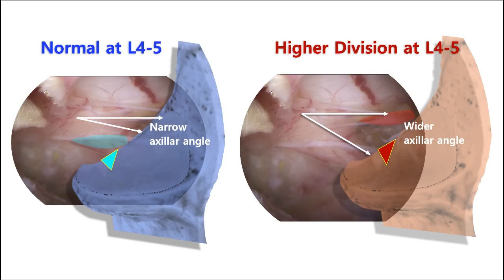When you punch the lamina at the middle of the lower lamina, you could misunderstand the dural lateral side as the root lateral side. And then, lamina punching by a Kerrison punch just beside the dura could injure the root at the axillary portion.